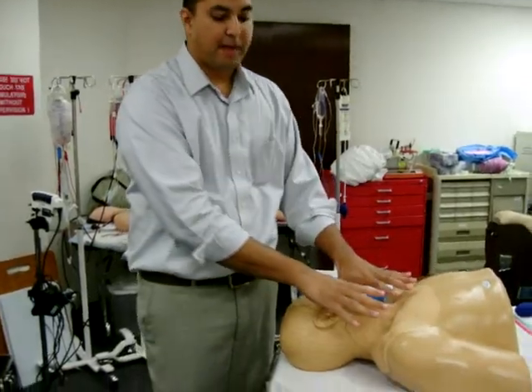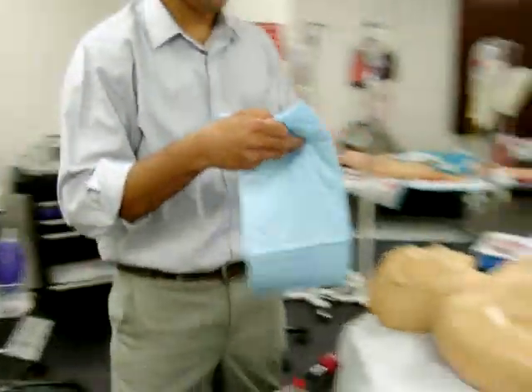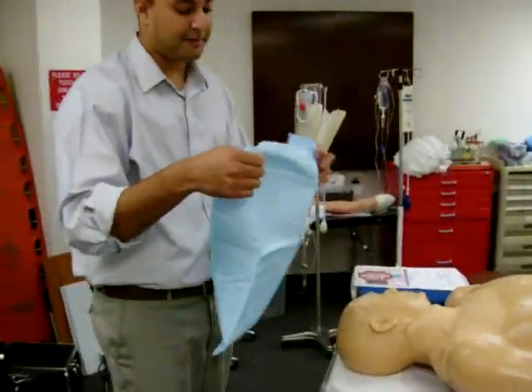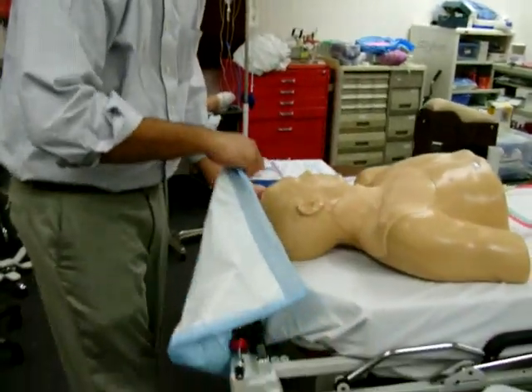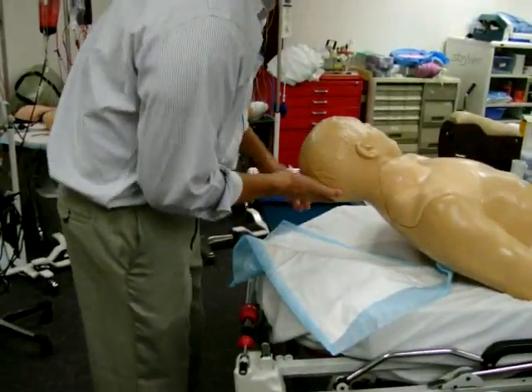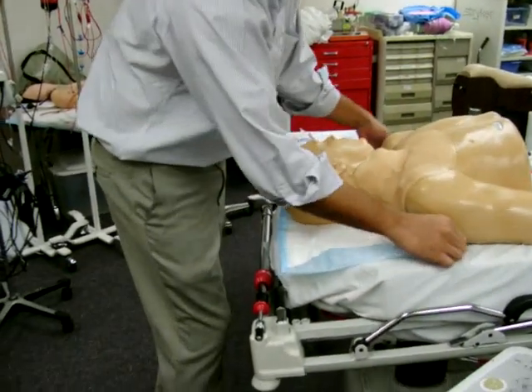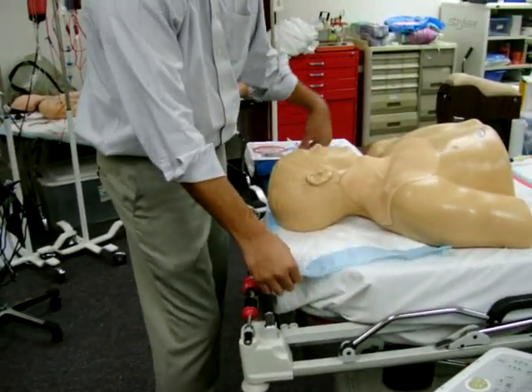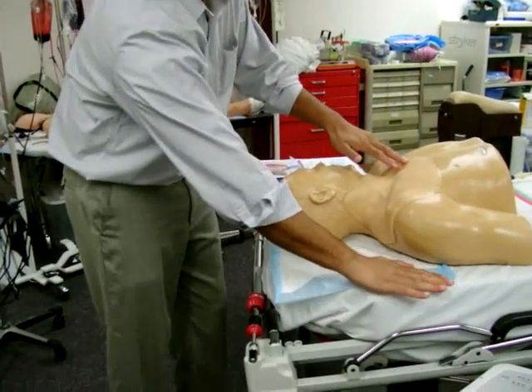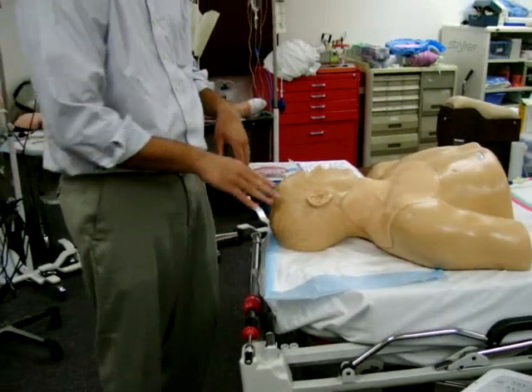Once we have our patient cleaned, you want to be kind to your nurses because you're going to be inserting a catheter and it may get a little bit messy — blood will drip down on the bed. So it's always good to place a chuck underneath so that if you have any blood, the worst thing for a nurse is to have to clean up the entire bed. So be nice to your nursing staff and go ahead and place a chuck underneath the patient's head.